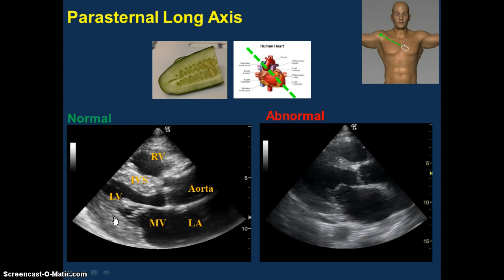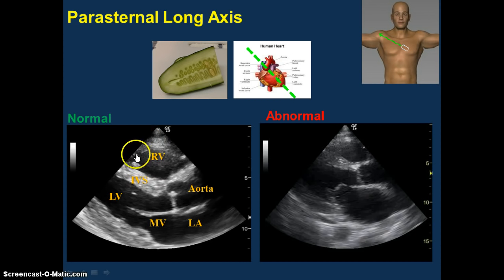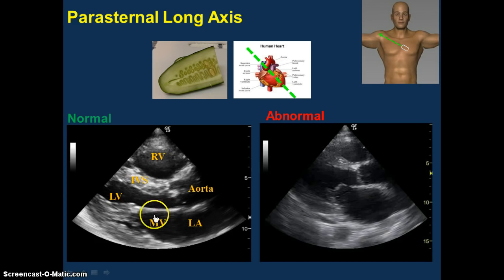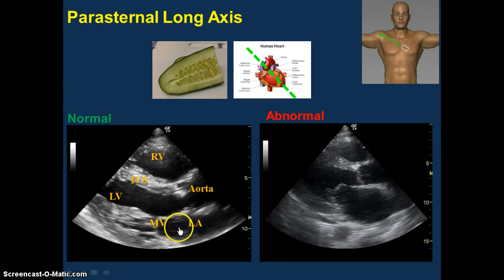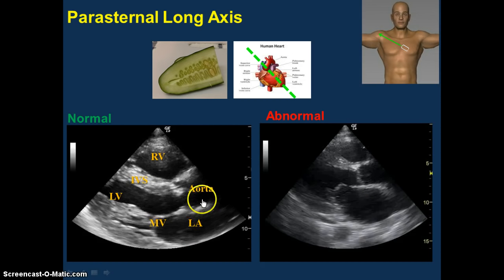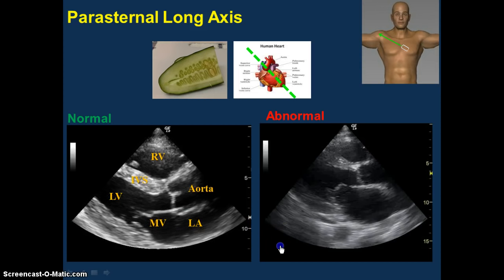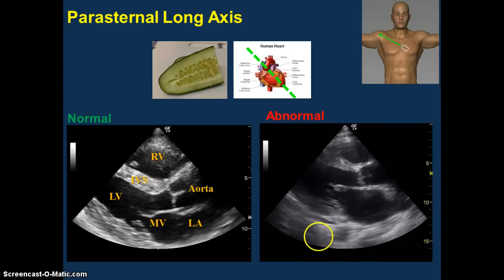We're just going to go over a couple of basic ones for the purpose of the CLU protocol. The most anterior structure of the heart is going to be the right ventricle. The next thing you're going to hit is the interventricular septum, followed by the left ventricle. Flapping away here in the middle of the screen is going to be your mitral valve — this is the anterior leaflet, this is the posterior leaflet. This here is going to be the left atrium, this is your aortic root coming out, and this is your aortic valve. So right away, that's a normal pumping heart here.